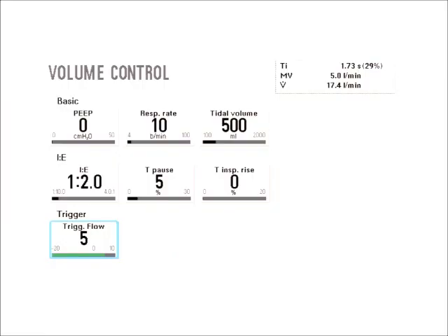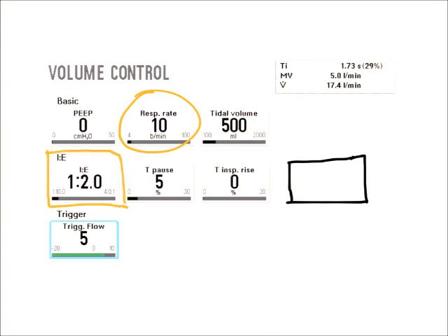So in traditional or newer ventilators out there, you notice there's no setting for an expiratory time at all, sorry. So expiratory time is a component of my respiratory rate. And with this ventilator, the default here is set for IE ratio. In an IE ratio, I get an inspiratory time, and then what's left over is the expiratory time.